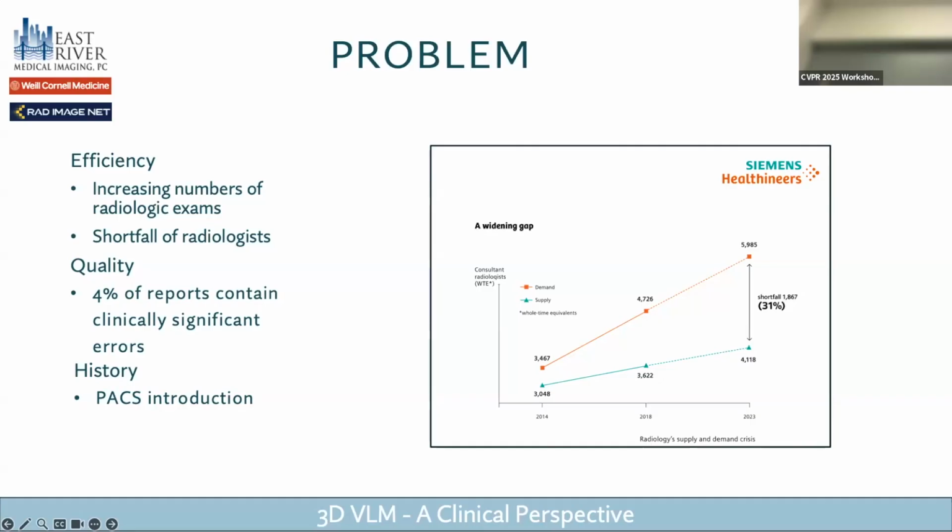I should just point out, as we're getting into this, the radiology community has been in this scenario before, right? So when I started training, a long time ago, things were not on computers. So I had to go get film. We had to put the film up and we all had to read the film. It was very inefficient. Films would get lost. Clinicians would take them. We never knew where they were. Very hard to read because you couldn't adjust the film like you can on a computer. But we transitioned to PACS. So PACS is the computer system that we use in radiology to read exams. And that transformation led to an incredible efficiency gain for radiologists. And I would contend that we're probably on the verge of something similar to that now with AI.